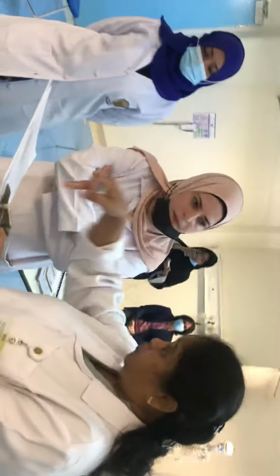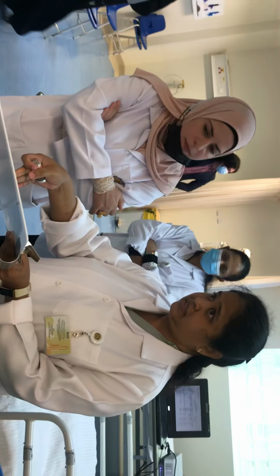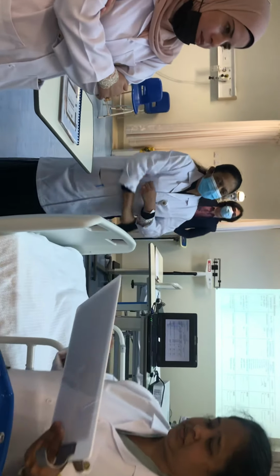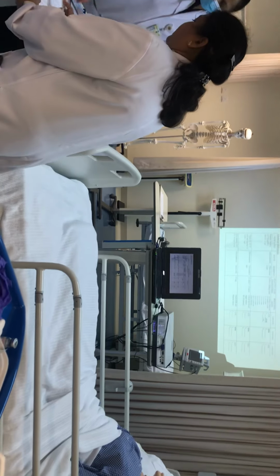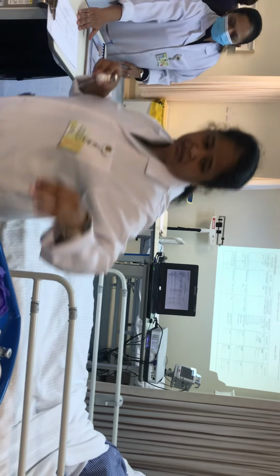So what all have they seen? The name, the units which are available, how much I need to give for my patient, and the expiry date. Keep these 4 things in your mind. They should never miss any one part. First check is over. Now the student is going to collect all the things because she has to go to the bedside of the person.